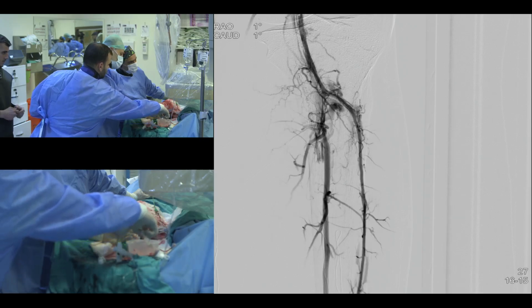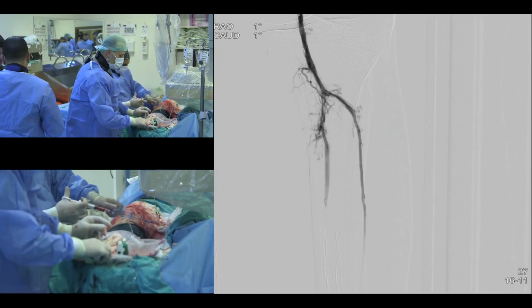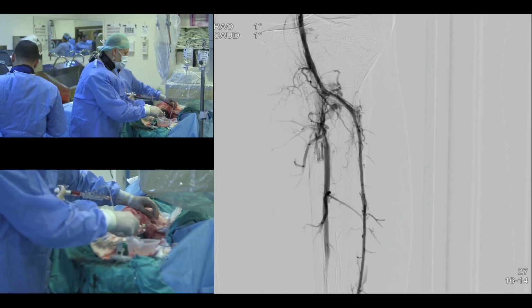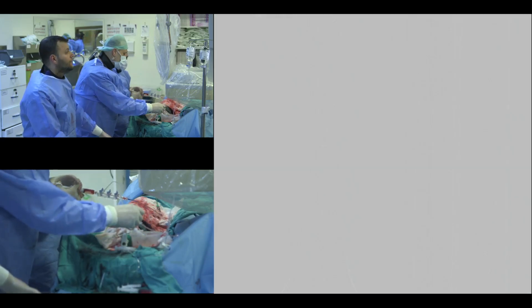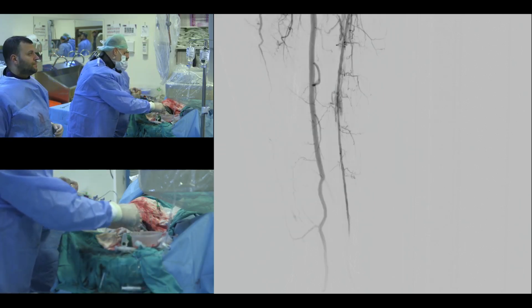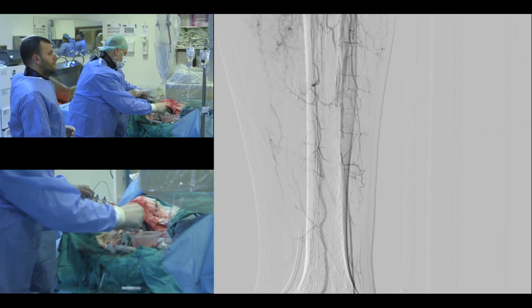An angio from the groin to the foot, again, you divide into severe stenosis or occlusion. If you have severe stenosis or occlusion, then you ask the question: is there calcification or not much calcification? If you have heavy calcification, then the approach is different as compared to mild. The same thing with occlusion. Severe stenosis with no calcification or mild to moderate disease, I still put a distal protection device because I may be treating in the anterior tibial and I don't want any debris going downstream. I just believe in that.